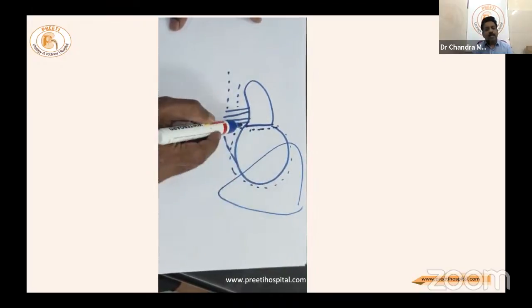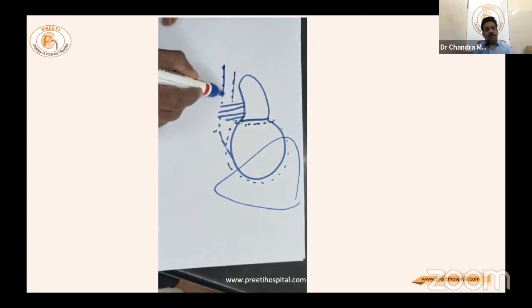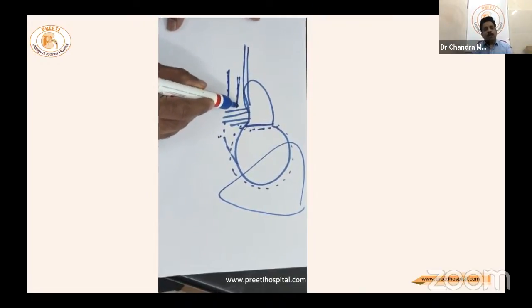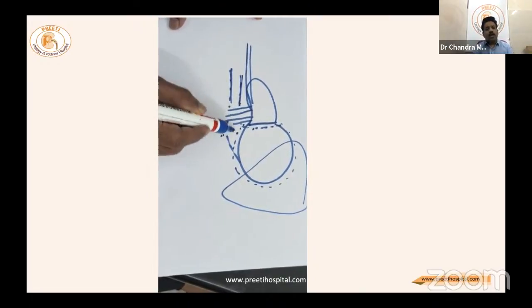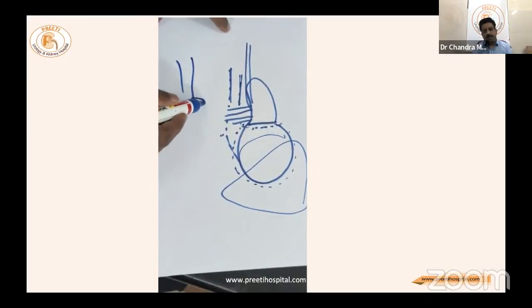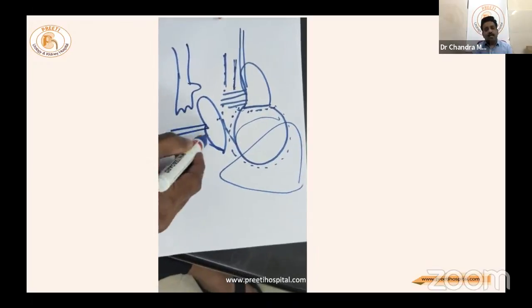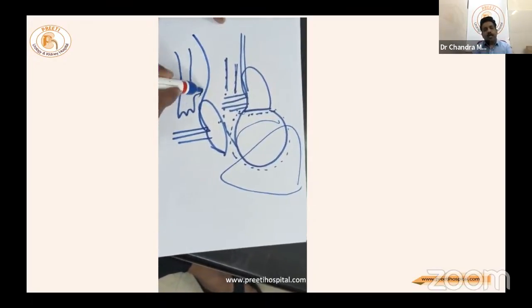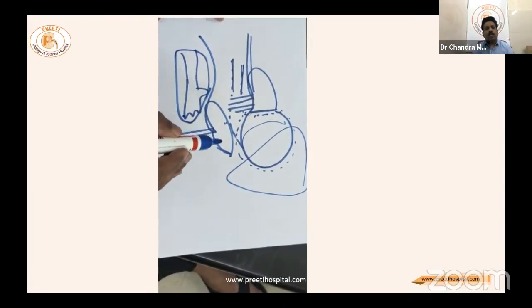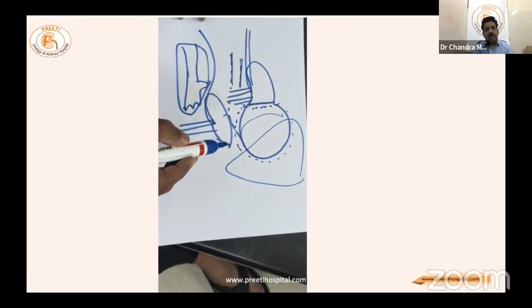The surgical steps involve opening and emptying the hydronephrotic sac, disconnecting it from the kidney. One artery and vein will be anterior, and the ureter of the lower pole will be normal. You must identify the lower pole ureter, remove the hydronephrotic kidney below the renal vessels without injuring the renal vessels or native ureter of the lower pole, and remove the upper pole sac through the port.